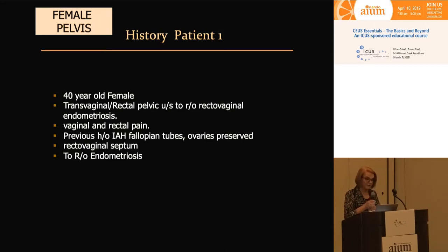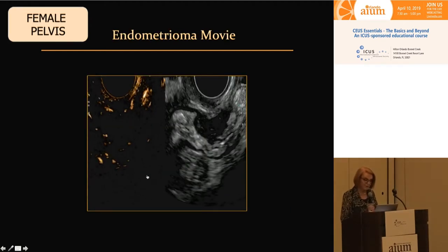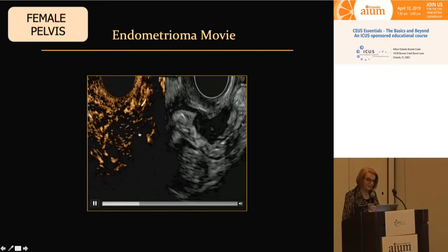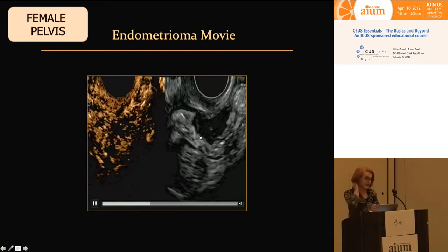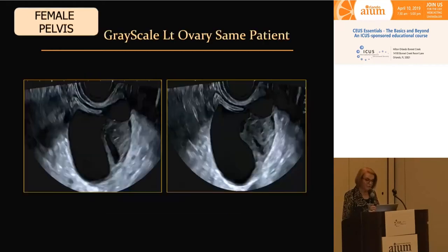Let's look now at the female pelvis. A 40-year-old female has a transvaginal rectal pelvic ultrasound to rule out rectovaginal endometriosis — she has vaginal and rectal pain. On this endovaginal scan, we're looking at her sigmoid colon. We can see the very typical appearance of the en-plaque, very hypoechoic mass lesion related to the bowel wall. When we do contrast enhancement, the bowel is enhancing, and the mass lesion is not avidly enhancing as a carcinoma would be — instead it is relatively hypovascular throughout the arterial phase.